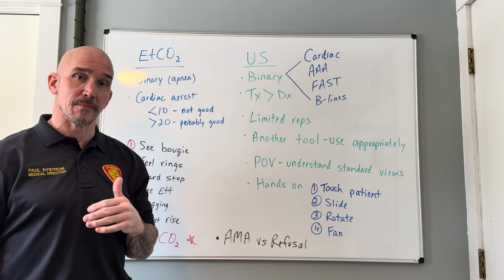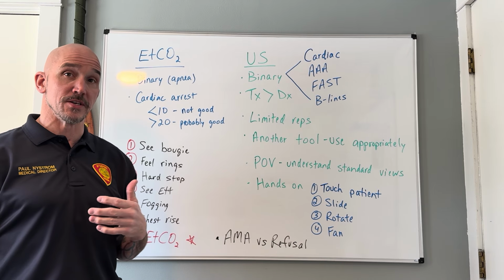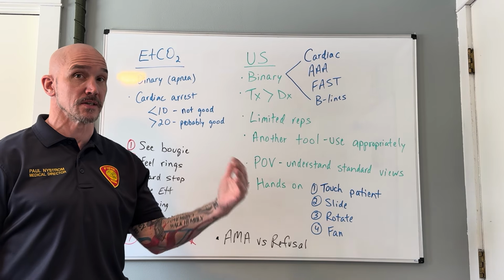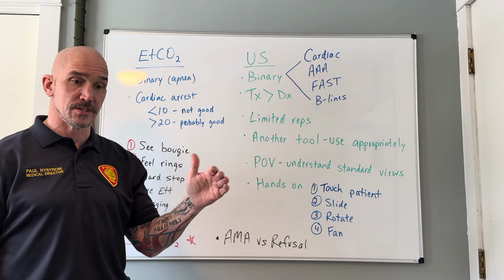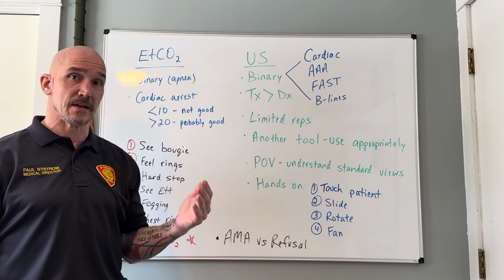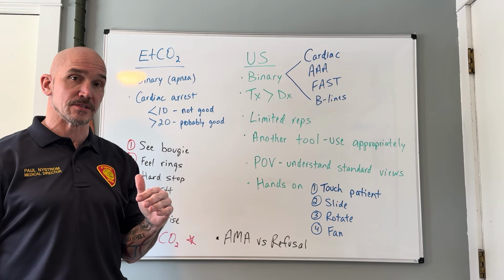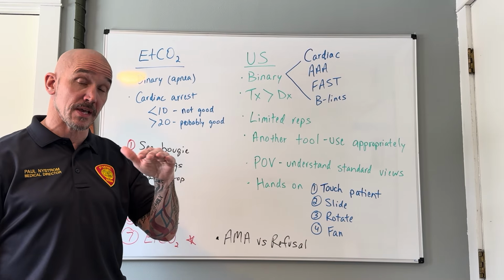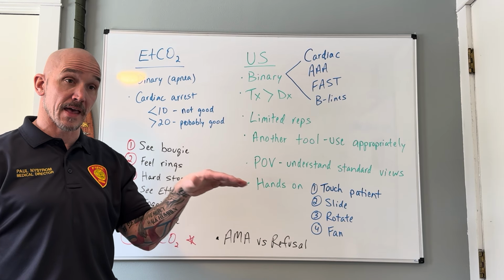The actual number, I'm not as concerned about. When I monitor patients in the ER for the same thing, like if I'm monitoring an opioid overdose that got Narcan and looks like they might need some more Narcan, it's really just, are they breathing or not? When we do sedations in the ER, it's the same thing. We're really looking at if they're breathing or not. The number is not so concerning to me.